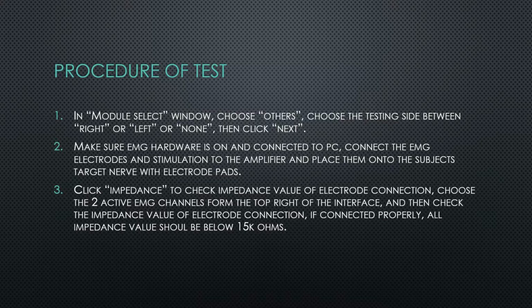The SSR technique and recordings were based on the procedures described by Shahani and his colleagues. An investigator performed all the steps of the experiments, and care was taken to avoid all external stimulation.